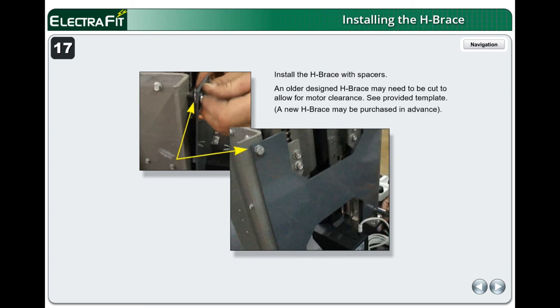Install the H-Brace with spacers. An older designed H-Brace may need to be cut to allow for motor clearance — see provided template. A new H-Brace may be purchased in advance. Install upholstery and clean it with window cleaner.